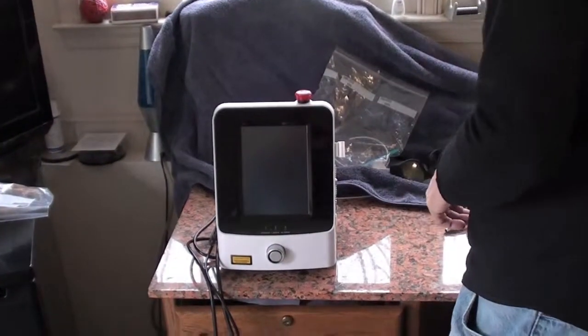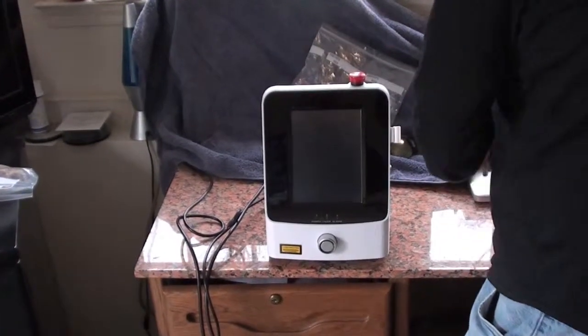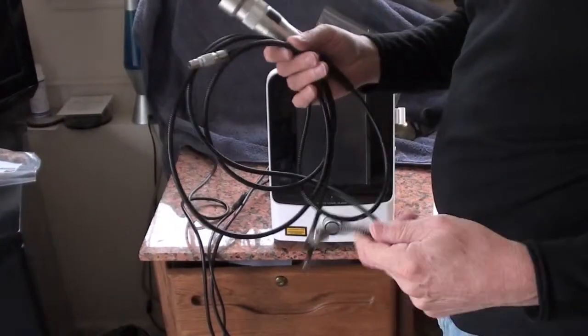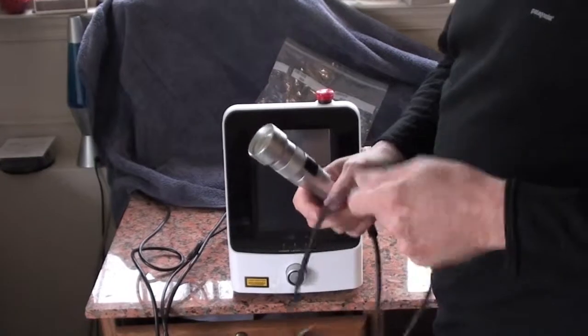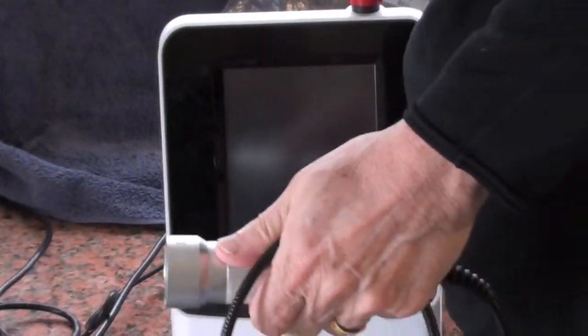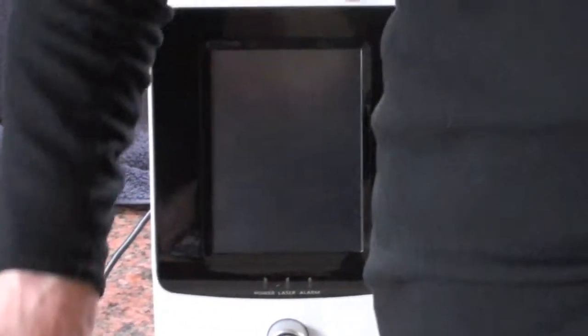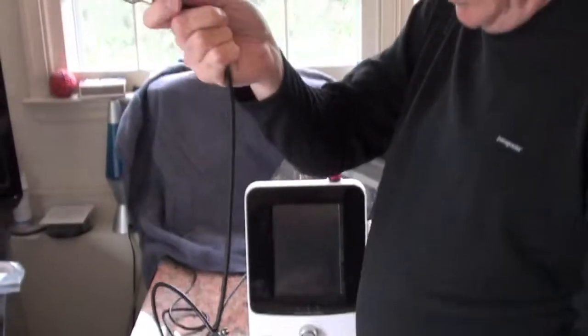So the next part is we're going to hook up the fiber. This is the therapy fiber. It's got two parts. It's got a fiber optic and a connection to the foot pedal. So you got to unhook the foot pedal back here. It's right next to the interlock. There, that's unhooked. You do not need a foot pedal. You use the hand switch.